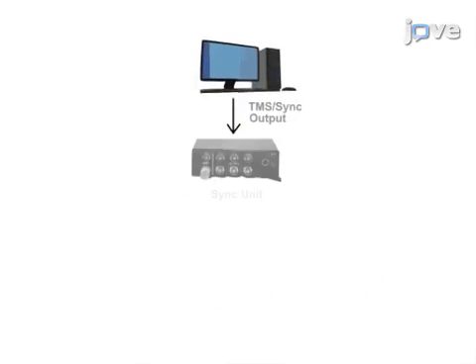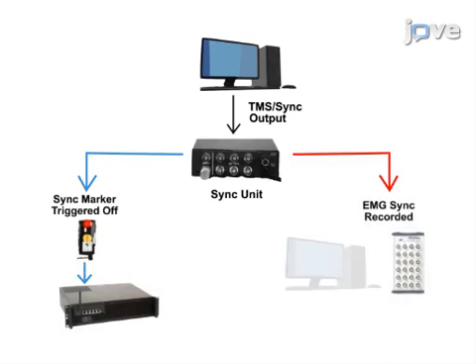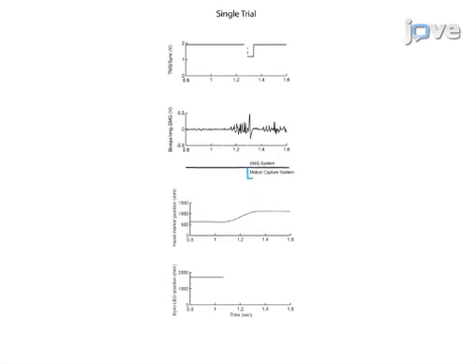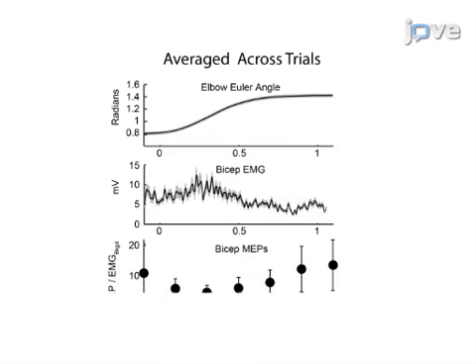As a second step, simple circuit components can be designed, which transform this event into signals appropriate for each recording device. Next, use analysis software to temporally align the synchronization events across the independently recorded signals in order to synchronize all of the signals. The results show that several biomechanical signals can be temporally aligned within the sampling frequencies of the respective data recording systems, which enable collection of a rich experimental dataset of human naturalistic movement to study neuromuscular control.